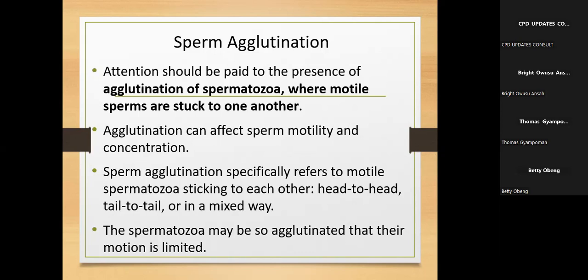All right, those are aggregations. However, if you have those sperms that are supposed to be moving, but one is entangled with the other, they are all motile, they are stuck to each other.